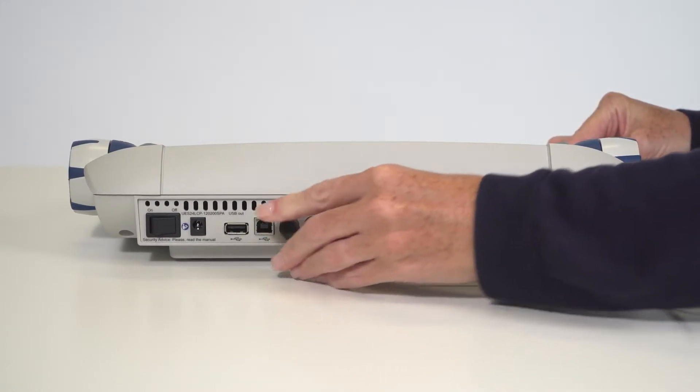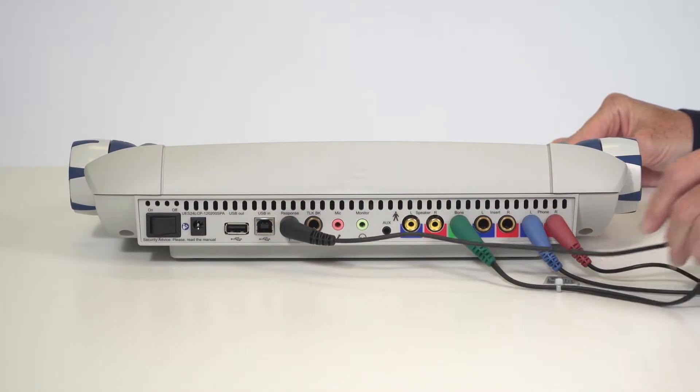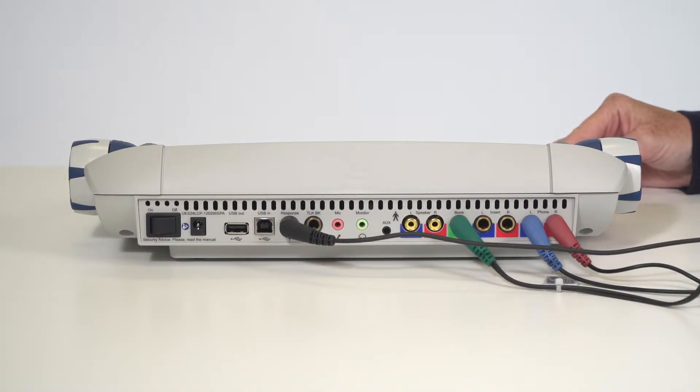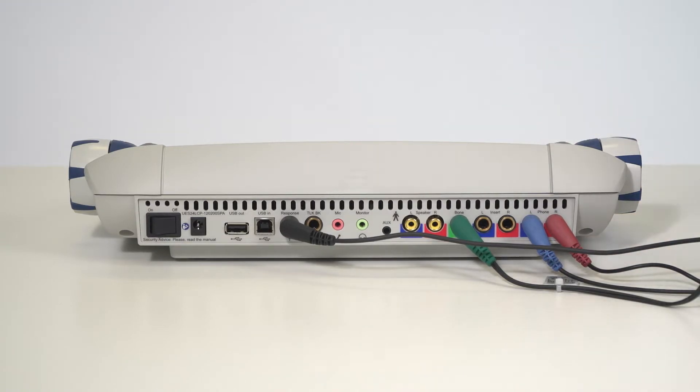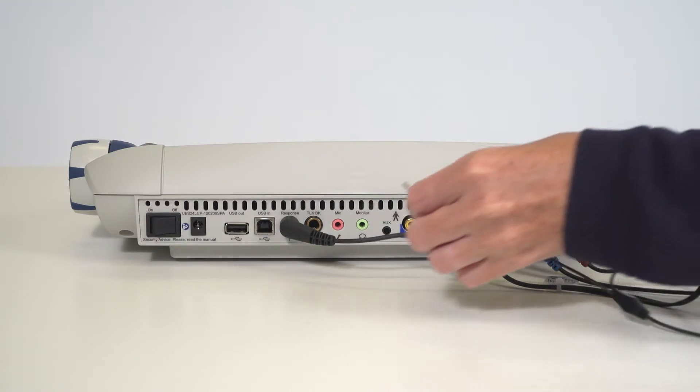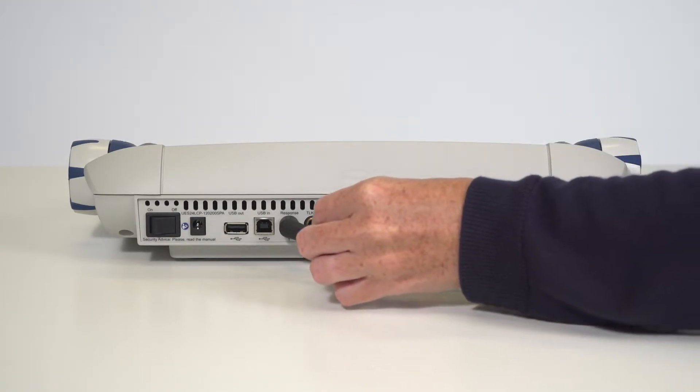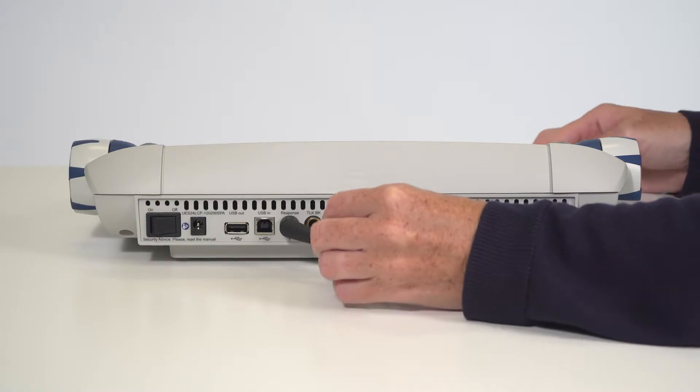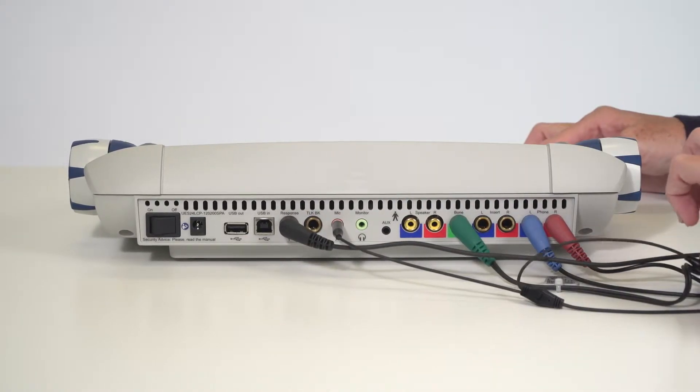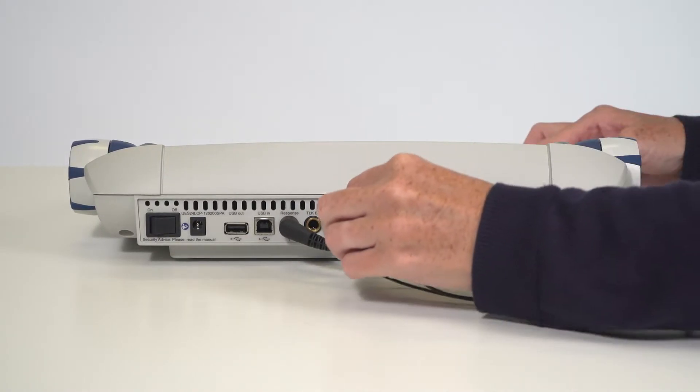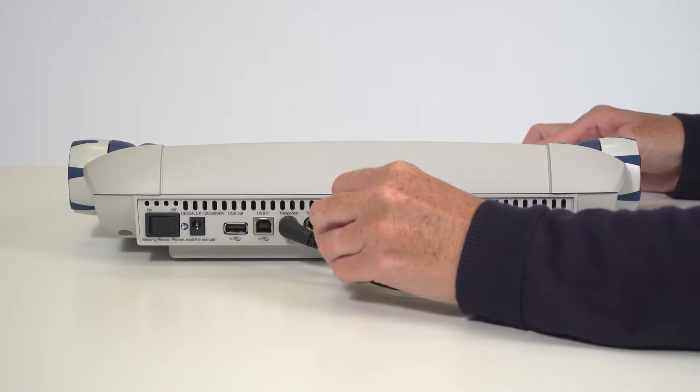Insert the patient response into the socket labeled response. Locate the plugs of the mic monitor headset. Insert the pink plug into the mic socket. Insert the green plug into the monitor socket.